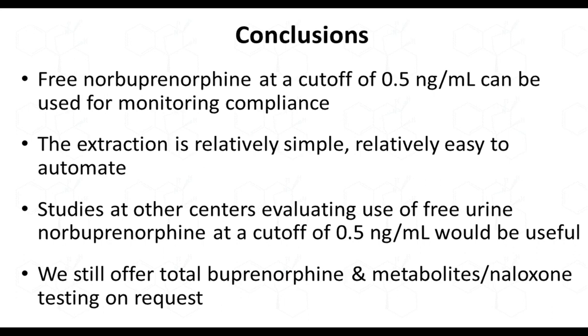And it looks like our next question is, how well have the clinicians in your health system accepted this approach to buprenorphine monitoring? So it was a pleasant surprise for us, and I think it just speaks to the excellence and the knowledge of the clinicians that we're dealing with, primarily one specialist in substance abuse treatment, that she is very open to looking at a different way of testing.